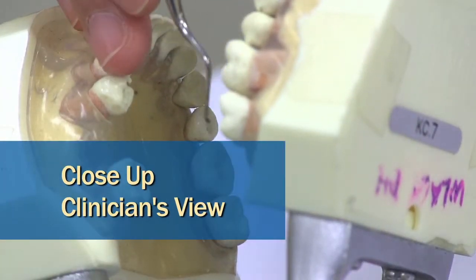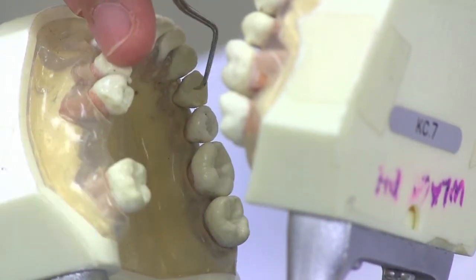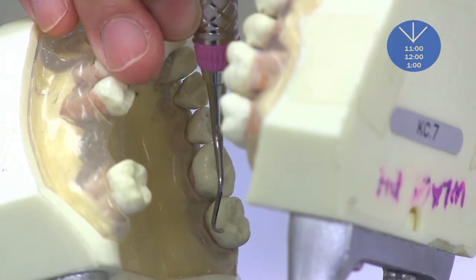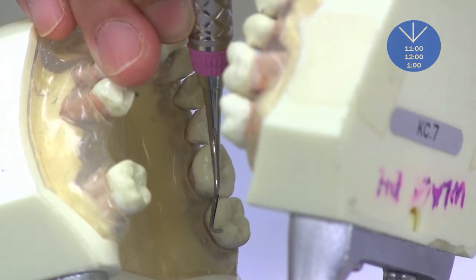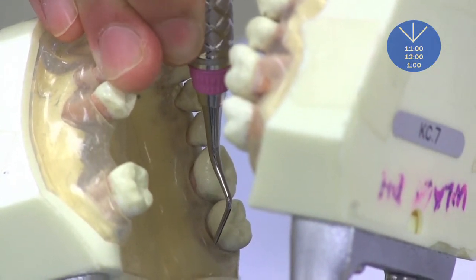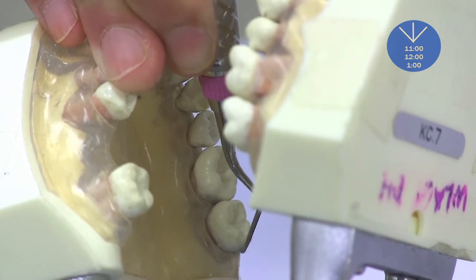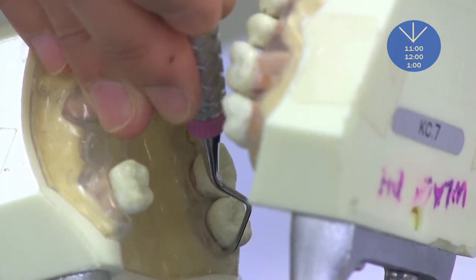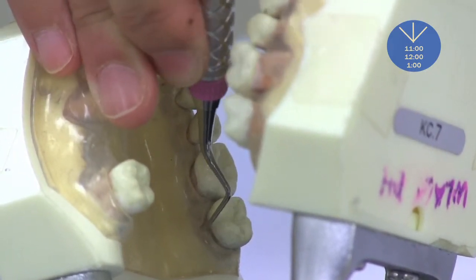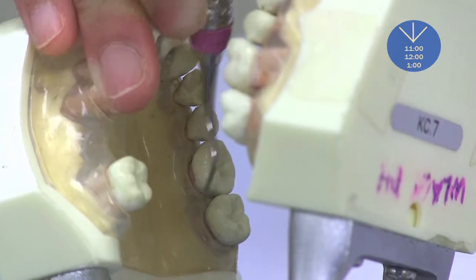Now I'm going to demonstrate universal curettes on mandibular right posterior teeth of the lingual aspect. For universal curettes on posterior teeth, you have to use two cutting edges. For the straight distal surface, you can start from the distal line angle, make the terminal shank parallel, angle to the distal, and go up and down. Then start again from the distal-lingual line angle and go towards the mesial using the primary cutting edge — the other cutting edge.